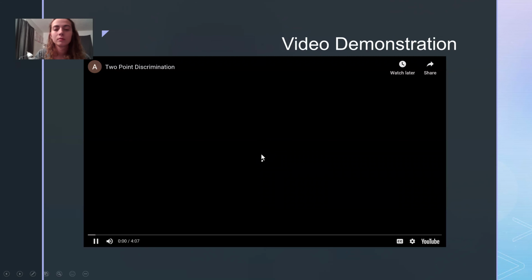This picture shows the 3 tools available in the assessment room for the 2-point discrimination test. The gray discs are the discriminator tools. The dark gray disc has the distances you start with, and the light gray disc has the larger distances if the client continues to respond incorrectly. The discs have been shown to have good inter-rater reliability and are the preferred choice among therapists.